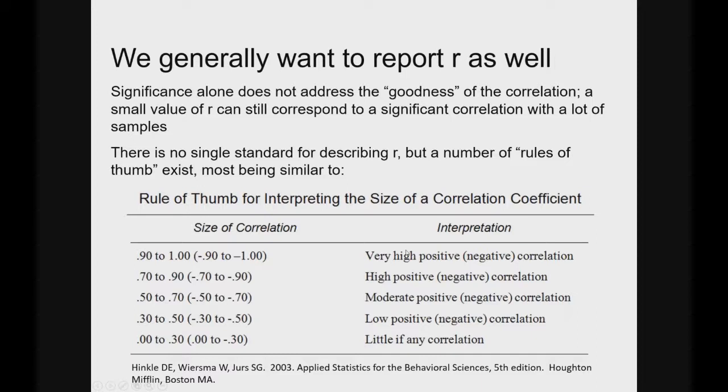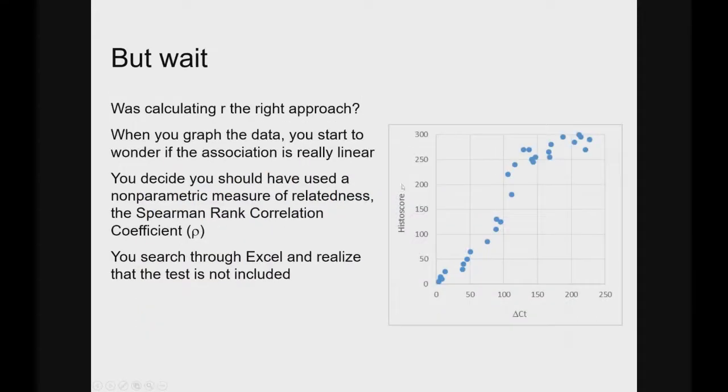Now, one thing here I want to point out is we felt pretty safe that we had normally distributed data, but we made a graph in the context of making a report on our study, we look at it and we're worried, maybe, is this really linear, right? We followed the linear regression model in our tool pack, but look, it starts to bend at the top. So maybe we don't have quite a comfort factor with using the correlation, the Pearson's after all. Well, if you have that concern, then you would go to a non-parametric measure, and the one you would choose is Spearman's rank correlation coefficient.